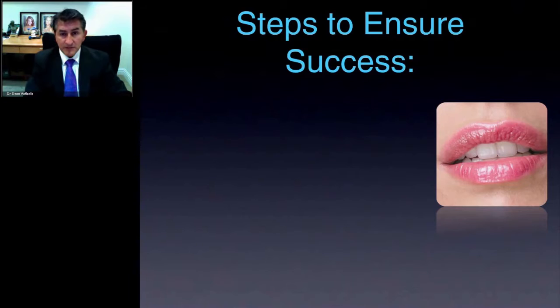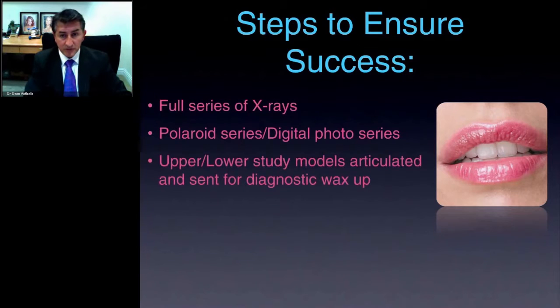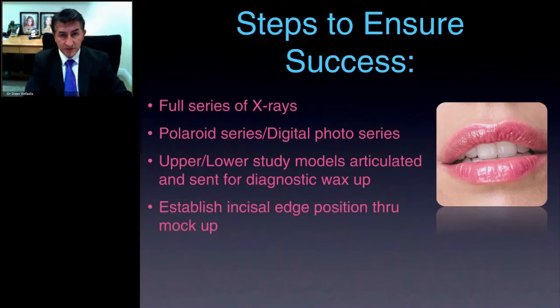For what we believe are the steps to ensure success no matter what restoration and what kind of patient you have, we take a full mouth series of x-rays. Obviously, it'll probably be digital. We'll do digital photography of the lips, the face, the extraoral features, their side view profiles, cephalometric x-rays, as much as we can get, and try to do that at our first visit, so we get really good records. We then establish incisal position if we're doing any kind of aesthetic work with either wax or with composite bond-on technique to show the patient the possibilities.